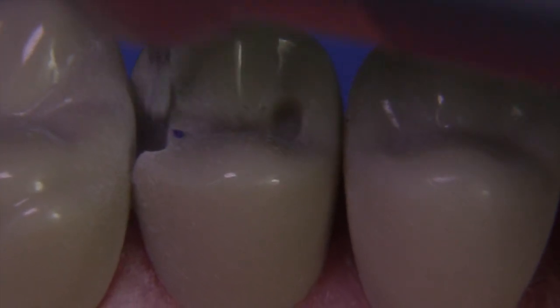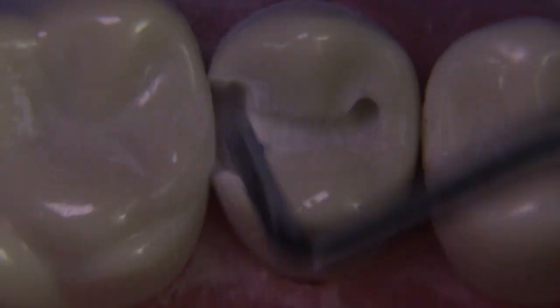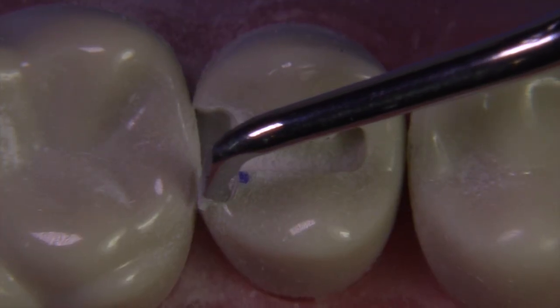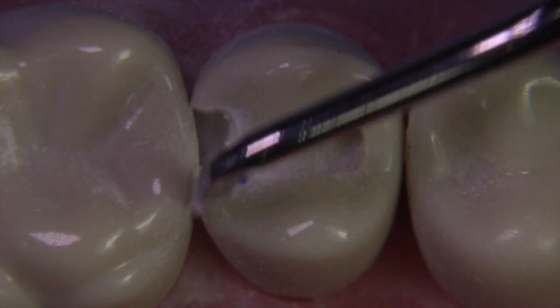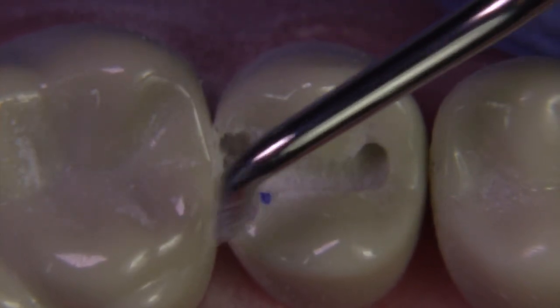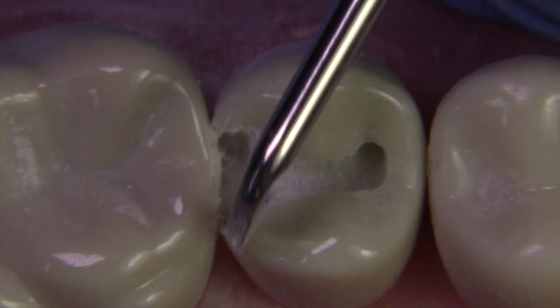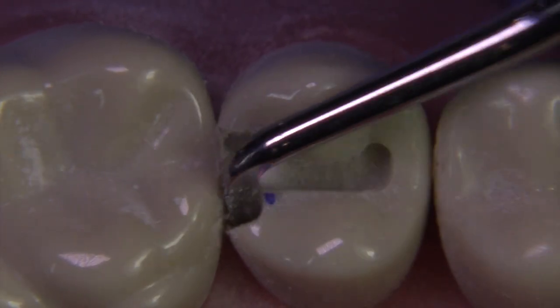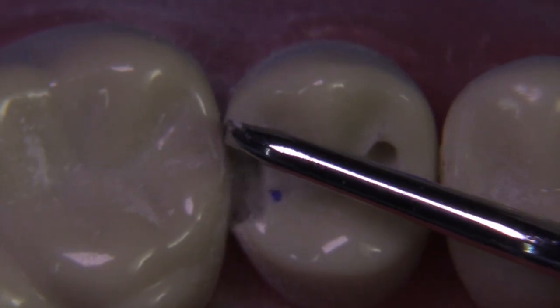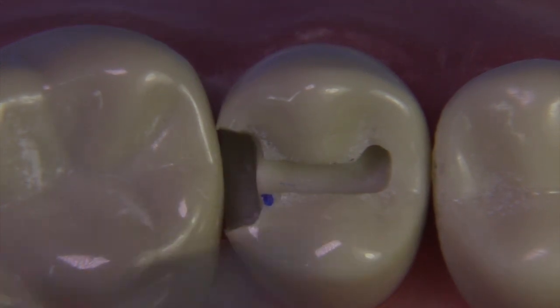We just continue on with this widening buccal-lingually, this undermining and chipping technique, to get the extensions we're looking for. You really have to use a very sharp enamel hatchet — I'd recommend starting with a new one and then learning how to sharpen them. I do have a short video on sharpening these that may be helpful. Remember, the exit angle is 90 degrees. Don't hold the instrument at an angle and make a flare. If your instrument is scraping up against that molar, your axial wall needs to be pushed in closer toward the pulp area.